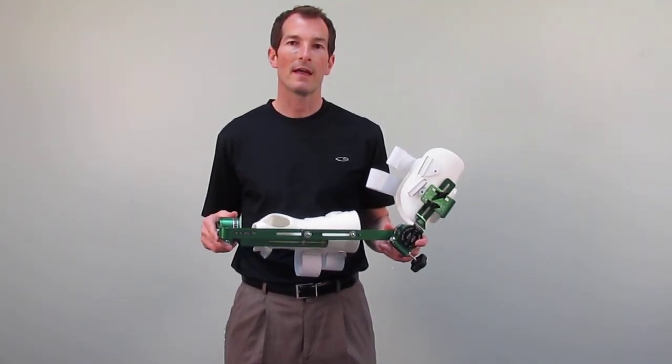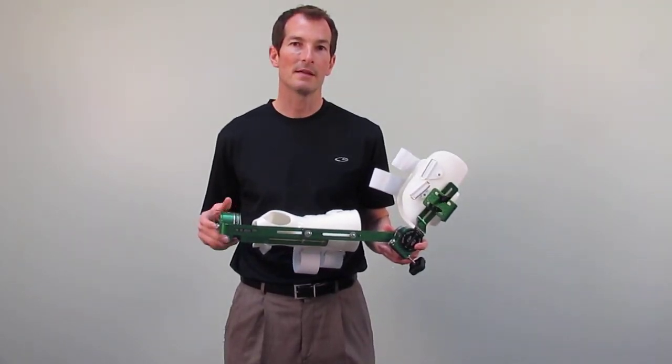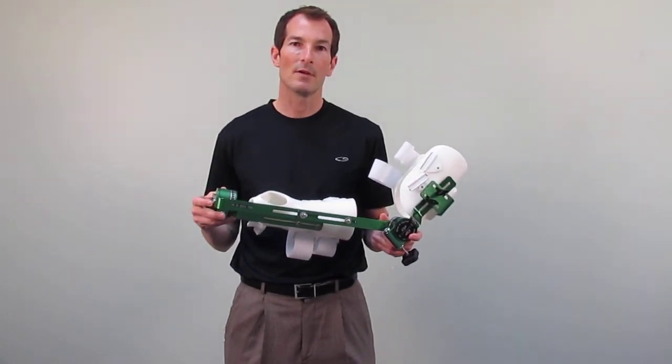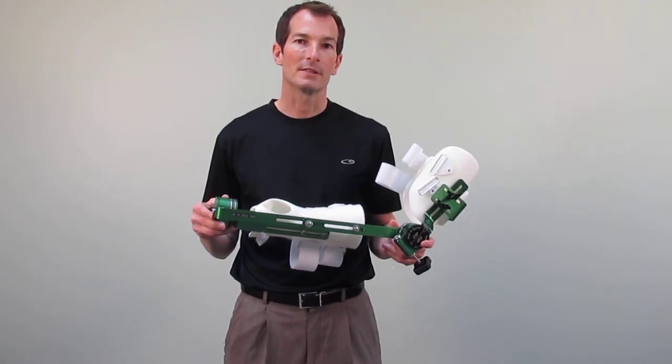Today we're going to discuss how to don and doff a Statadyne ESP device. An ESP device is a combo device that actually allows you to do both supination pronation and elbow flexion extension.